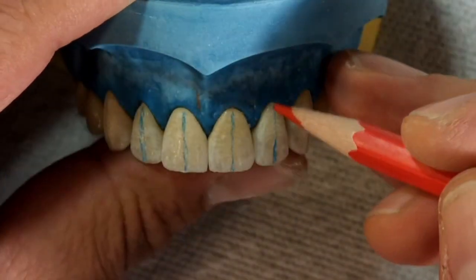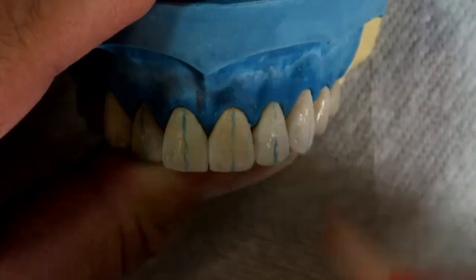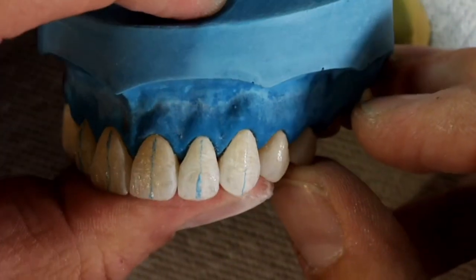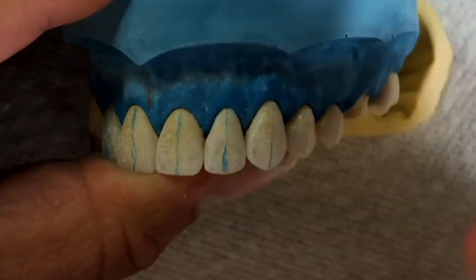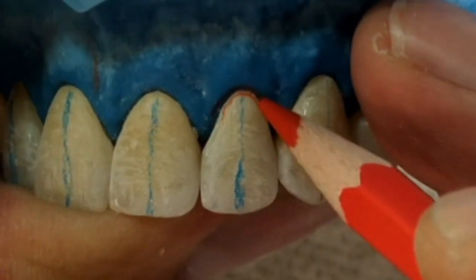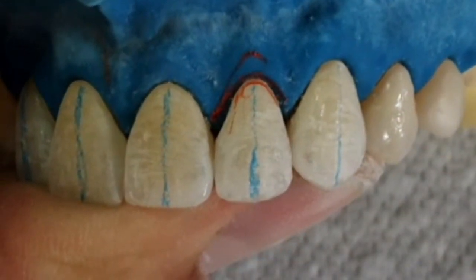The first step in contouring the teeth is the long axis. The long axis is an imaginary line that runs vertically through the center of a tooth. All anatomical features must be in the correct relationship to the long axis for the teeth to appear natural. There are certain rules we need to follow when it comes to the long axis.